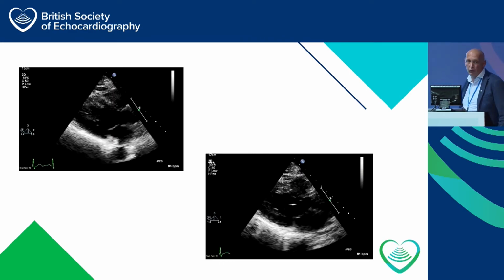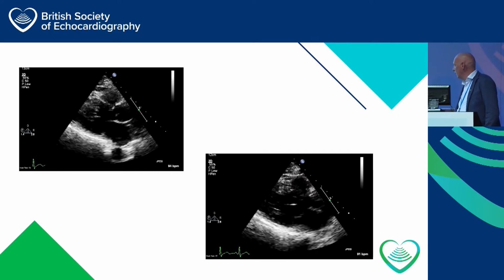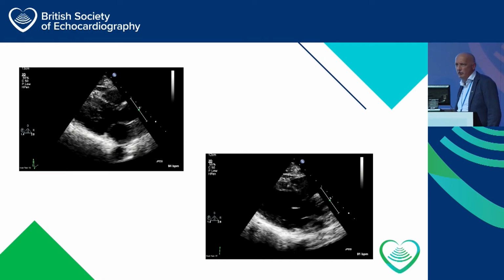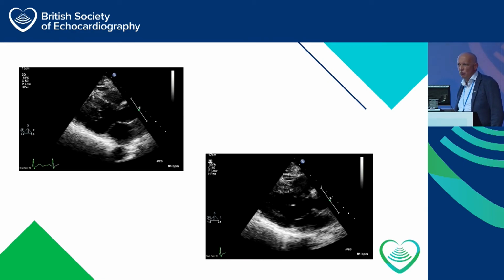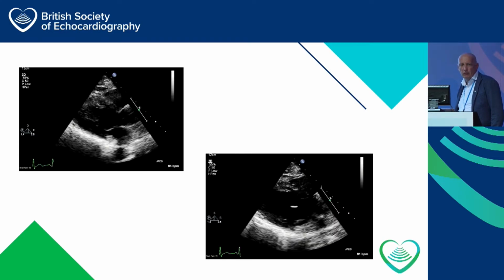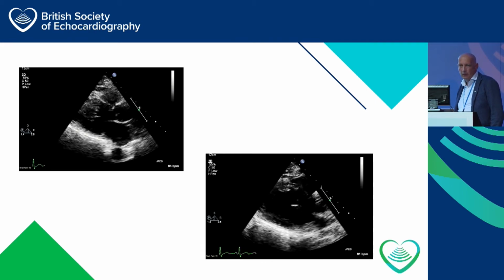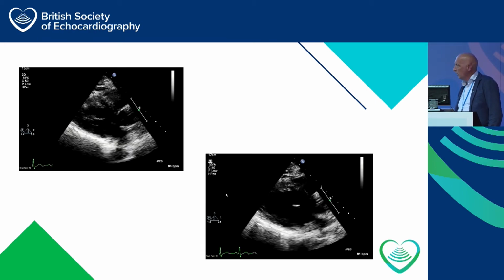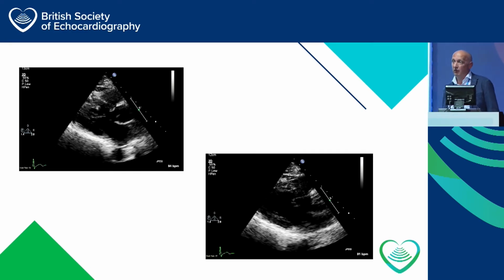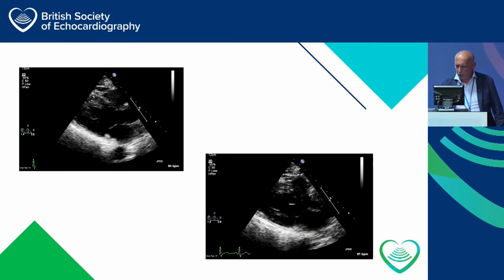You can tell already that the valves are pretty mobile. There's no colour, there's not much else there. But there is a slight bright echogenic structure right there in the middle of that cavity. Can you see it? Does anybody think that's unusual? And if something has got a reverberation of that stature, that's got to be something, hasn't it? Because it's very bright. It's not a typical LV band. It's not an implantable lead, because I've already said she hasn't got devices in, and why would it be flapping around in the middle of the left ventricle? But there's a bright structure.